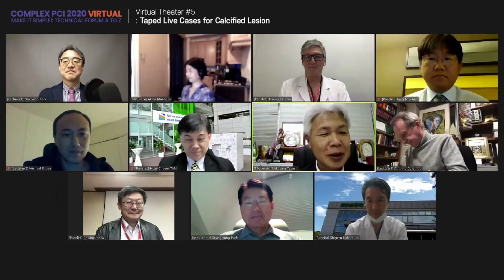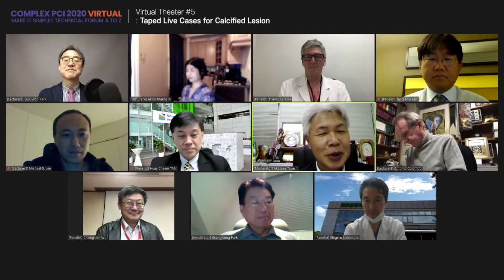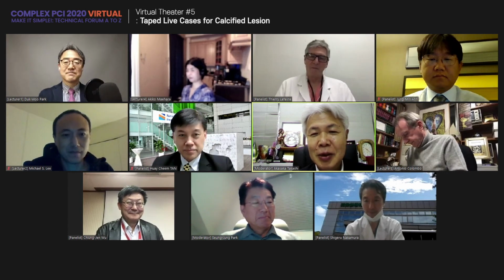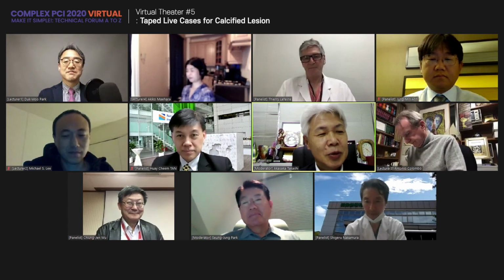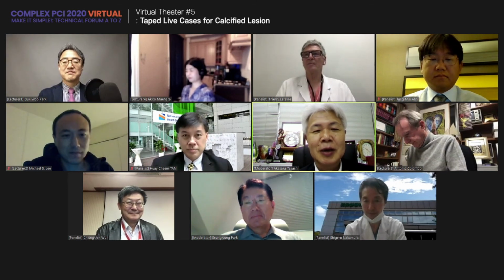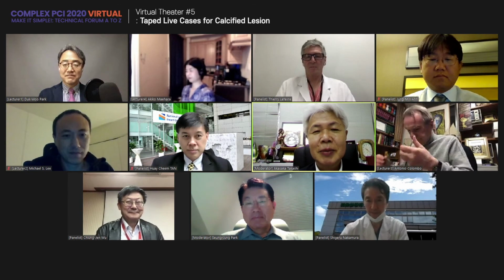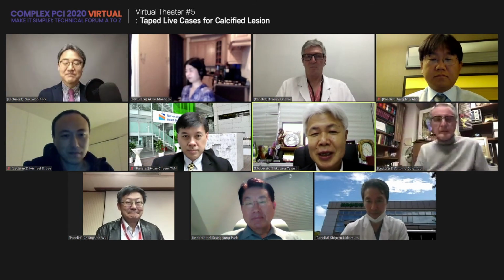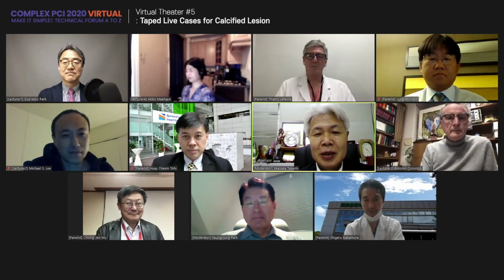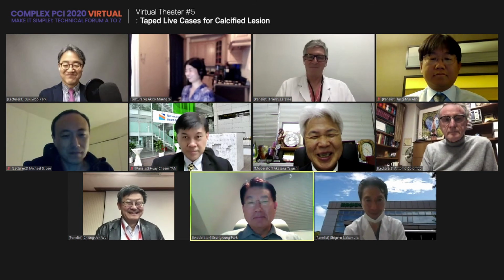Severely calcified lesions are still a big issue in daily practice, and imaging is very useful. We now have lots of techniques to approach the calcium, and a combination of each technique is the best way to overcome the calcium, I think. So, Dr. Park, is it okay? My summary? All right.